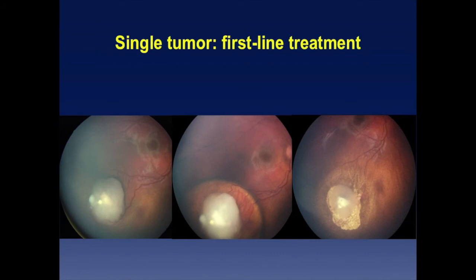Ruthenium can be used as first-line treatment — for example, a peripheral unilateral retinoblastoma requiring no chemotherapy at all. I control the plaque intraoperatively, confirm 2mm safety margins, and achieve regression type 3. Follow-up laser is applied in the irradiation bed to avoid complications. You end up with a truly surgical margin of irradiation — the macula is perfectly healthy. Another first-line ruthenium case showed complete regression.